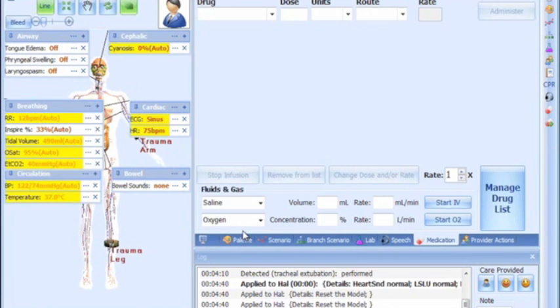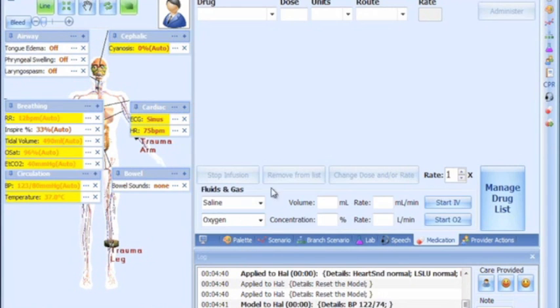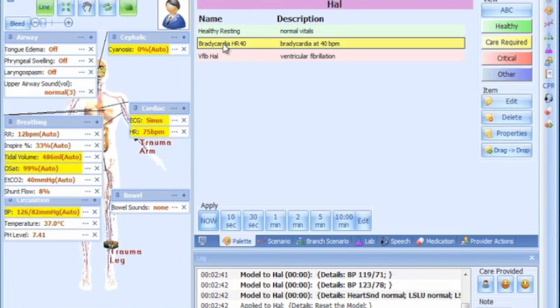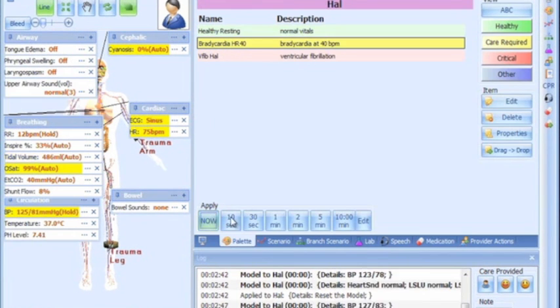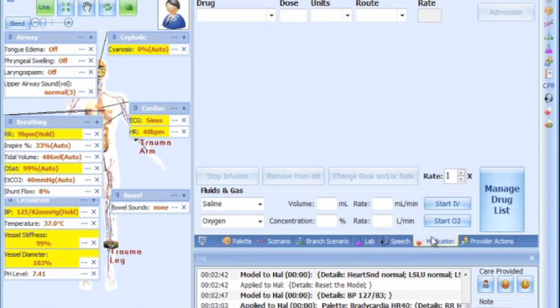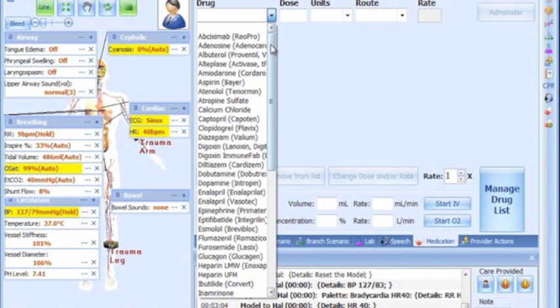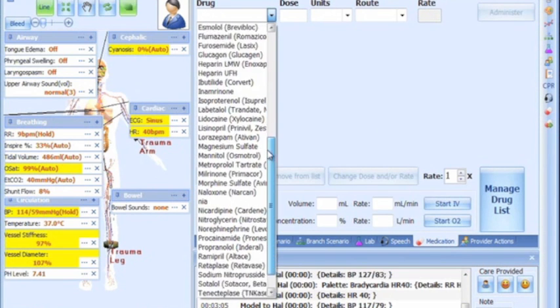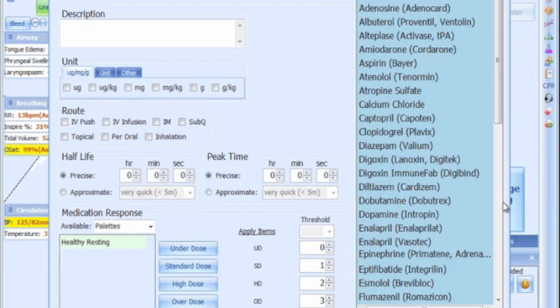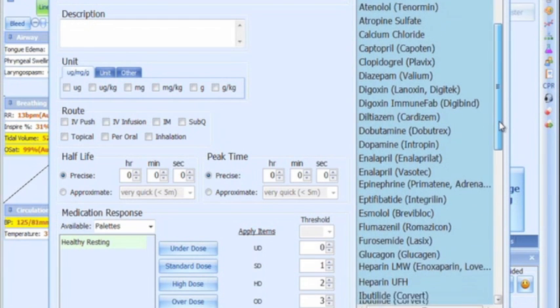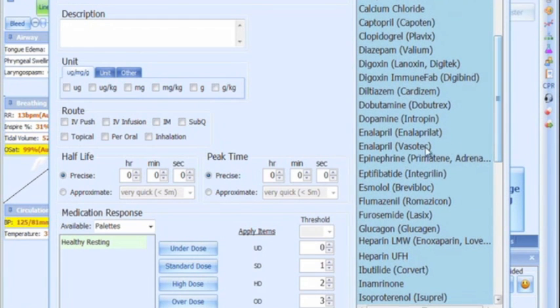The model used in this operating mode was developed based on physiologic principles. Features unique to this mode include a comprehensive list of drugs for easy administration and a drug profile editor for adding new drugs or editing existing ones.